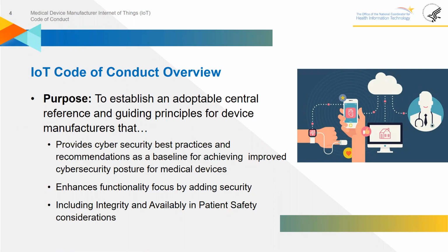At this time, as a workstream whole, we understand that the manufacturer's primary purpose is to focus on the medical device functionality, compatibility requirements, customer convenience, and time to market, with security concerns coming in on the low end of the list, or in some cases, not at all.